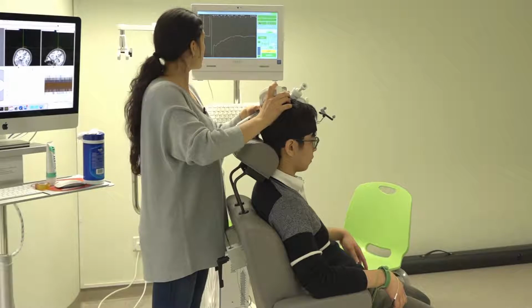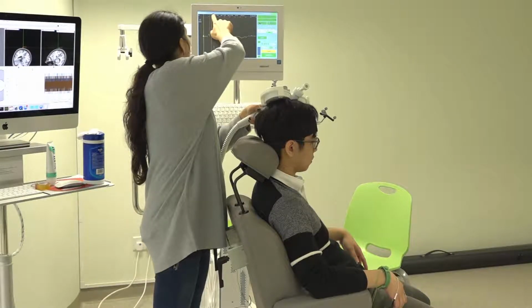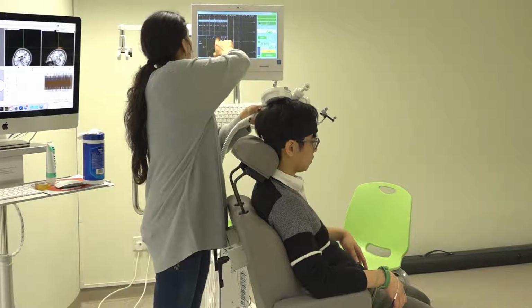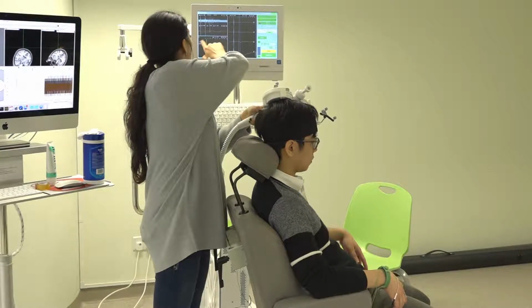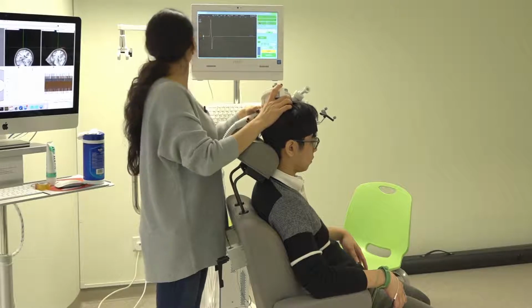So we got it here. Okay. So we have here a beautiful MEP.